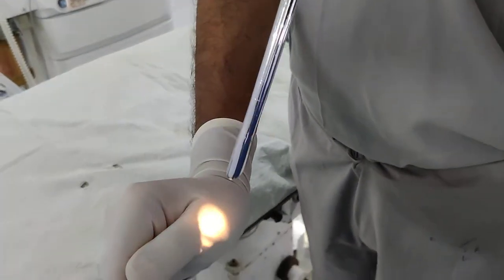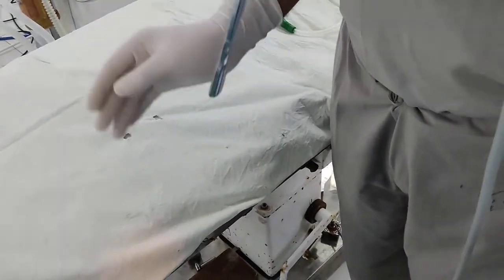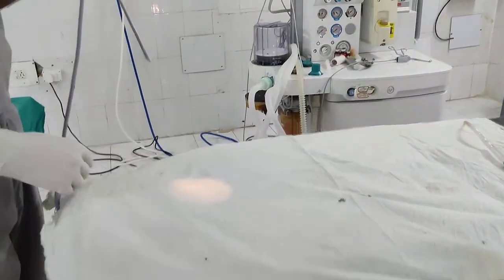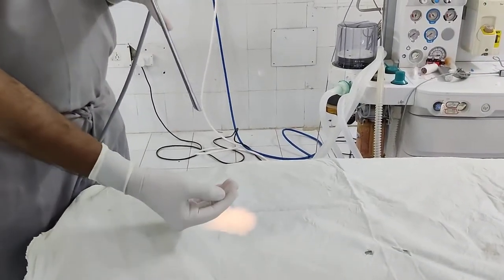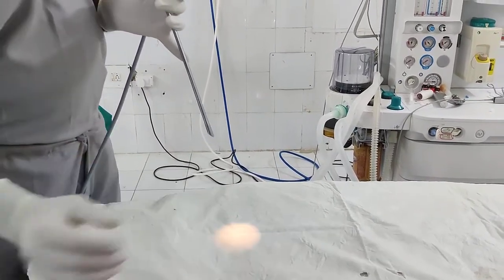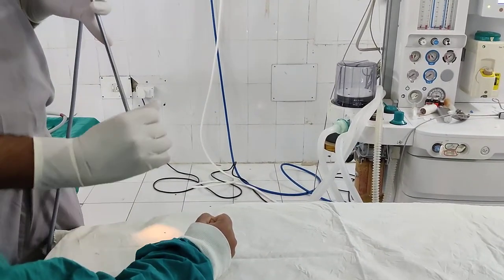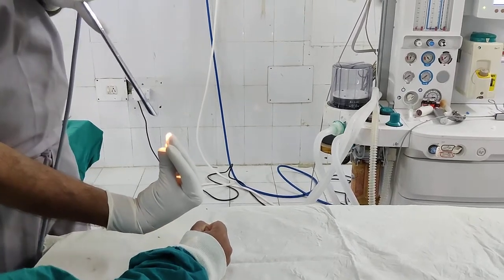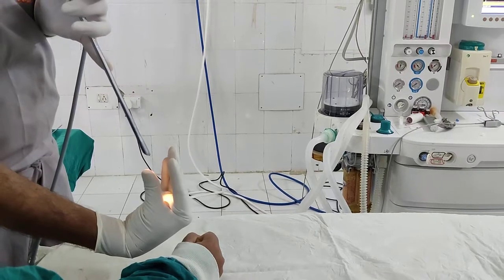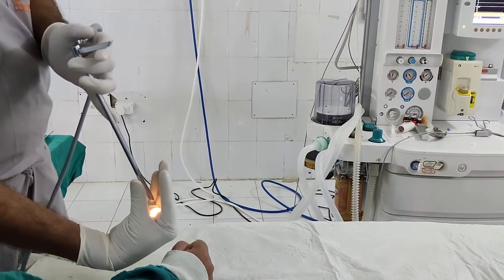If you want to see the pyriform fossa, how would you do the esophagoscopy? The patient has to be kept in a supine position like this, with almost 10 centimeters — just a minimal amount of extension — with a pillow below the neck. Once you put your hand like this, this is the esophagus for example, and I have to reach this esophagus. Initially the patient will have their mouth like this, so you have to open the mouth and then put the scope to this side and that side, going on to the tongue till the level of the vallecula.